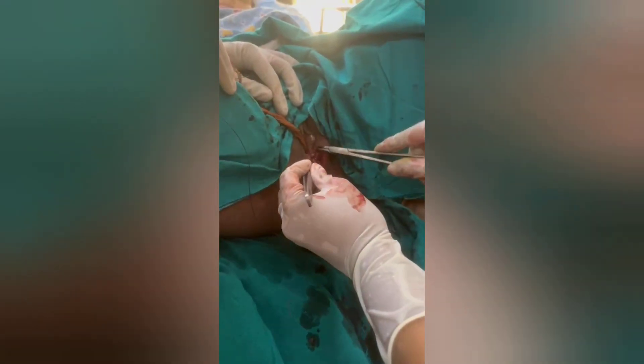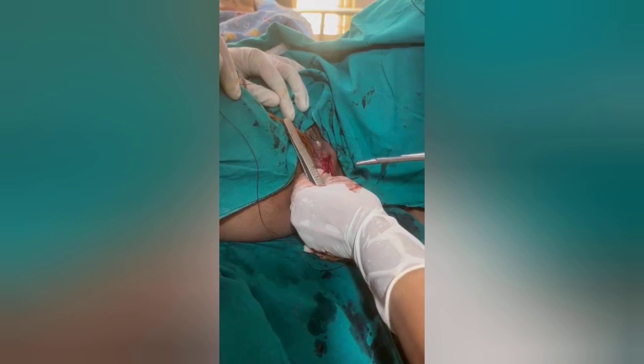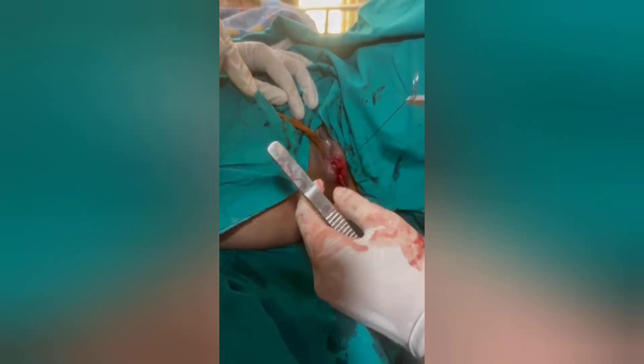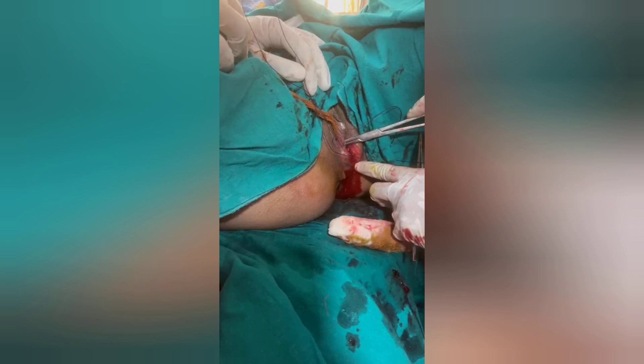The deep transverse perineal muscles are being sutured, obliterating the dead space. If any bleeders are present, they should be ligated individually. This is a tension-free suture — no tension, no locking. This is the deep perineal muscle layer, continuous second layer.